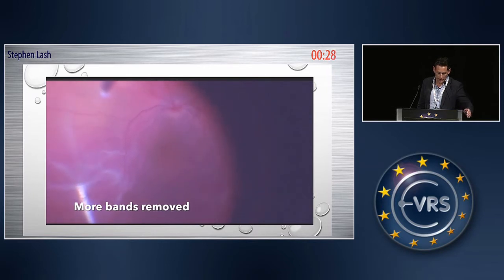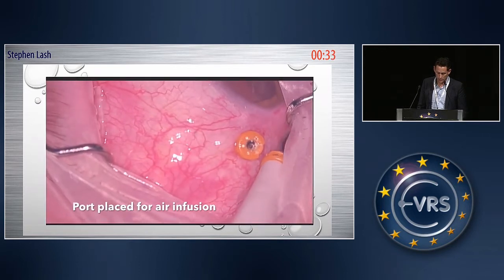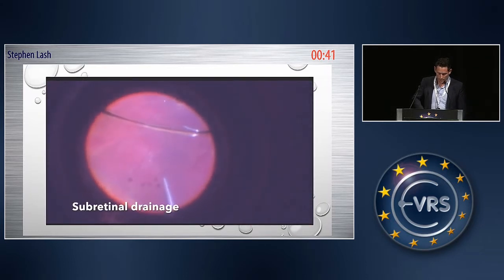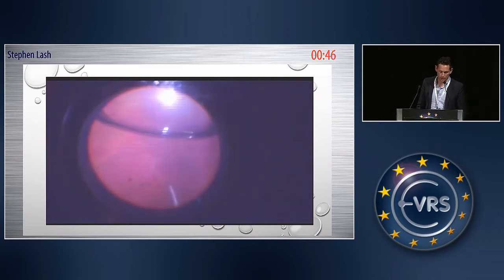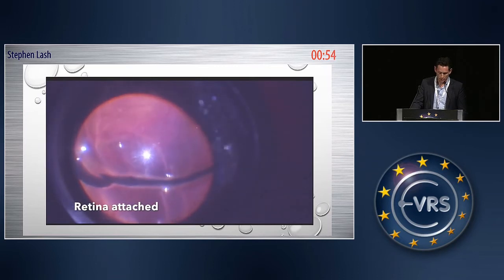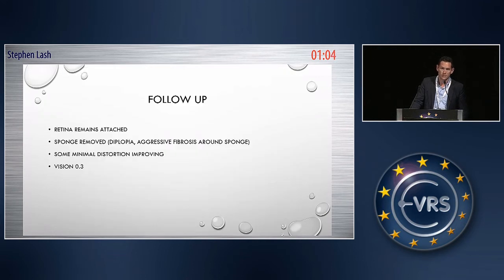So having removed all the bands, I then tried to drain and realized that I couldn't drain, because there was no real positive pressure. So I put another 23-gauge port in, just a bit of air to create some pressure, and drained with a flute underneath the retina. And I guess if I was really brave and not treating myself, I'd have stopped at this point. But I did go on to do some laser, just around the buckle. The retina reattached, and you can see that with good laser uptake along the edge of the buckle. And there we go — before and after. 0.3 vision, some distortion. Thank you.